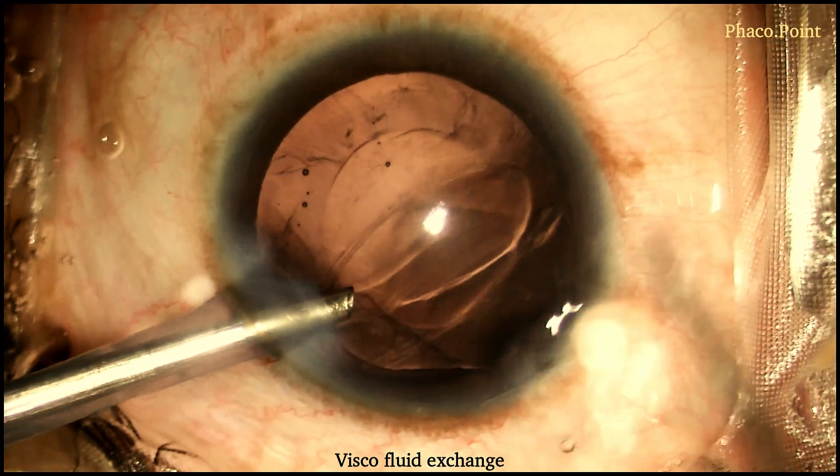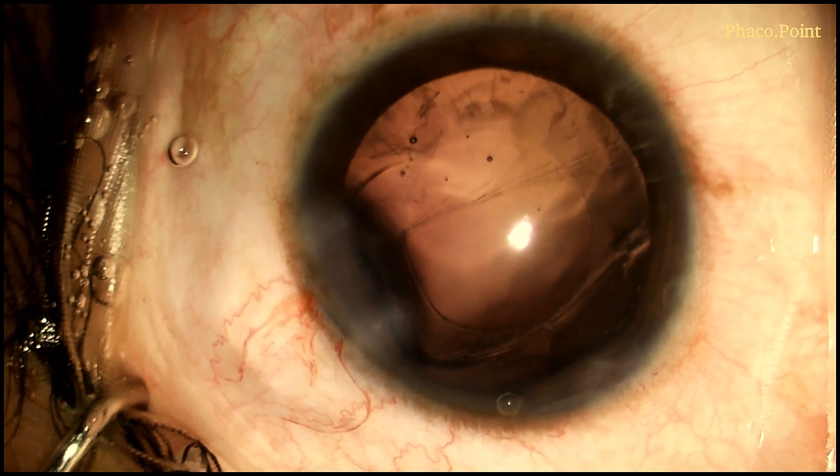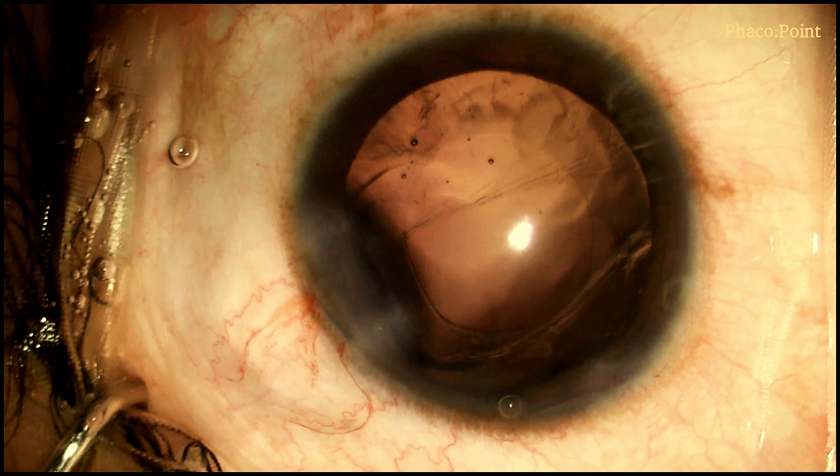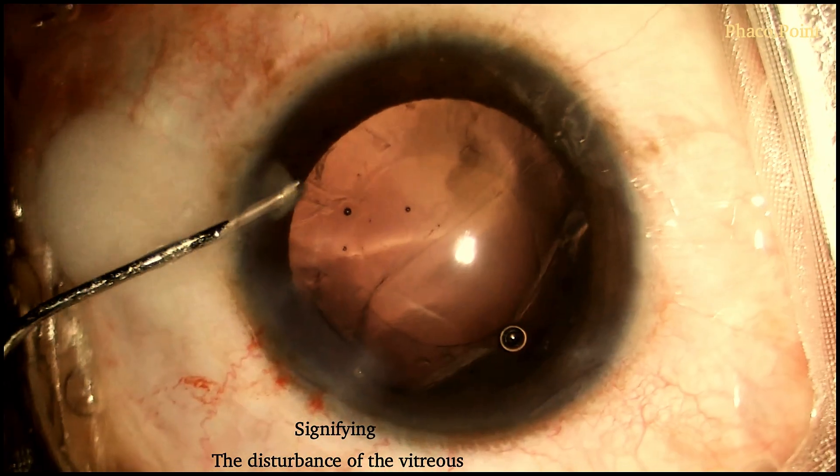As the visco fills and replaces the fluid in the anterior chamber, the probe can then be withdrawn. In this particular case, however, despite performing a properly done viscofluid exchange, you can notice there's an extension in the size of the rent. This signifies the presence of a vitreous disturbance.